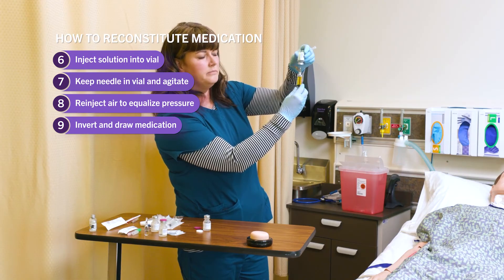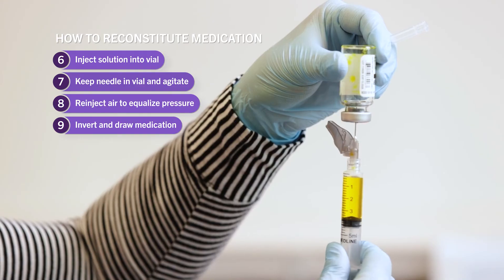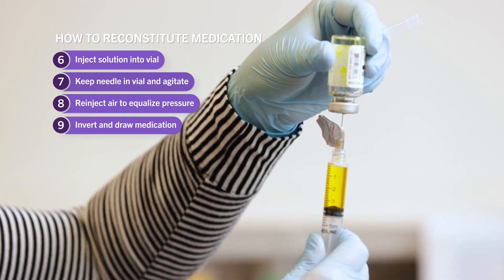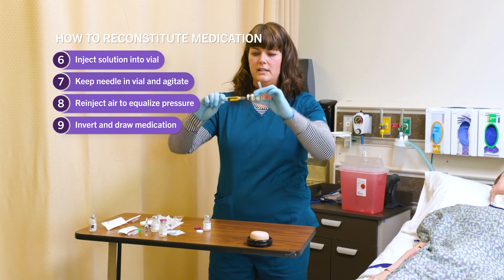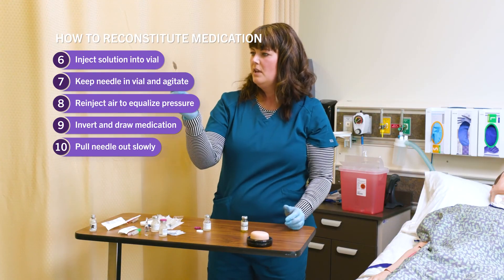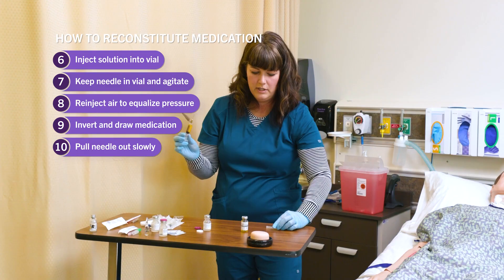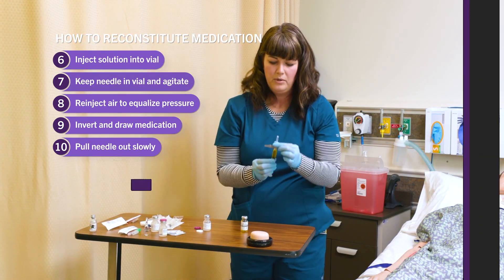I'm pretty happy I've got out all of my medication. I have a little bit of air in there, so I can inject that back. I want to be very careful to keep all that medicine in. If you're giving an IM injection, it's okay to have a tiny air bubble — you just want to make sure to get all the medication. I'm going to pull my solution, push that small air bubble out slowly. Now I need to go in and give this to my patient. I recap and I'm ready to go.